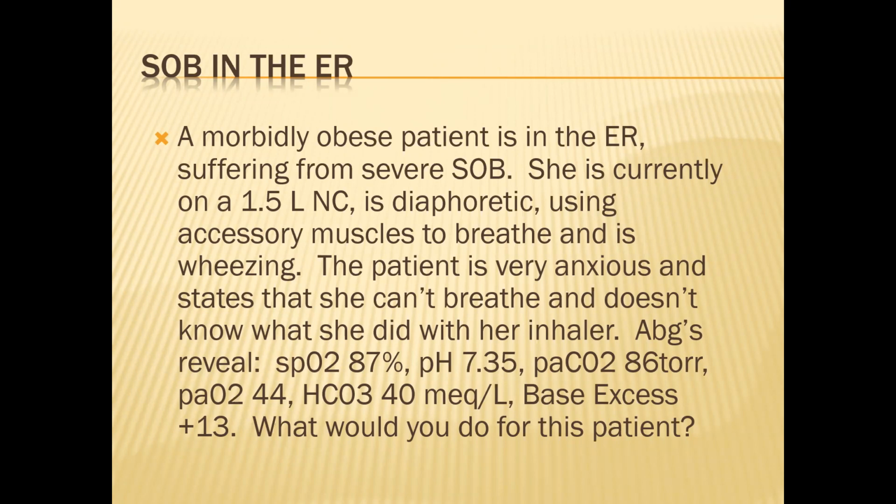So breathing treatment, yes. Putting her on a venti mask is better than a nasal cannula because you're giving a specific FiO2 and it doesn't change with breathing pattern. So I know on your NBRC exams, if you have a CO2 retainer, you're going to recommend the venti mask, not the nasal cannula, but the venti mask. Bronchodilator. And now what about helping her with her work of breathing?